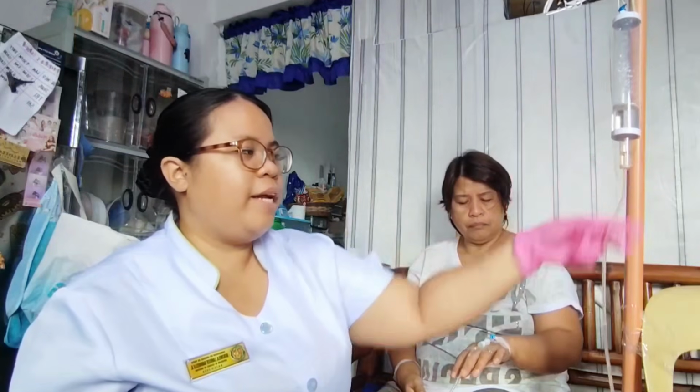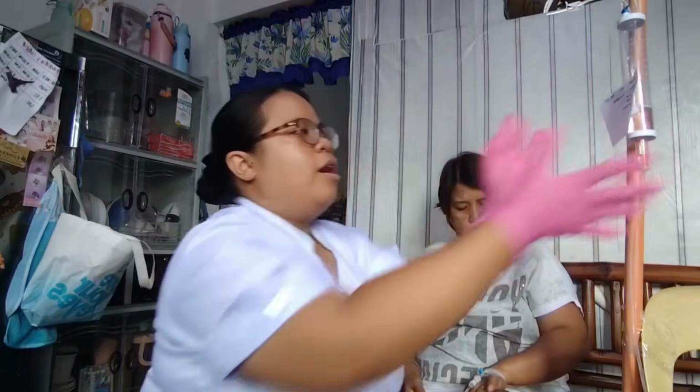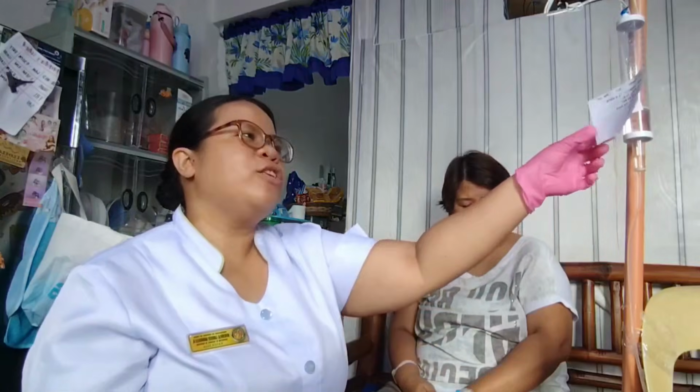Okay, so after regulating the infusion rate or the flow rate, we will now proceed in putting on the IV label or the medication label on the volumetric chamber. So, the details that are included here are the patient's name, the age, sex, the room number, the medication that we have administered, which is ceftriaxone, the dose, the total volume, the rate, which is over 30 minutes, and then also the date and time that started, and who prepared the medication.